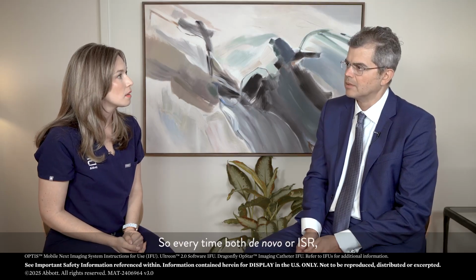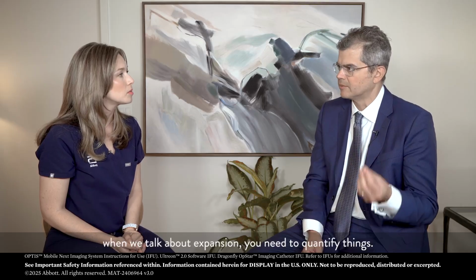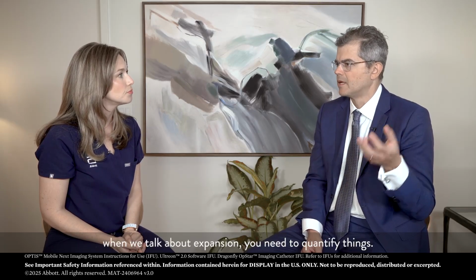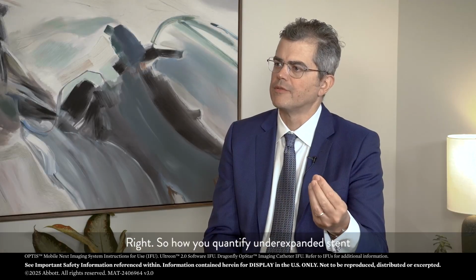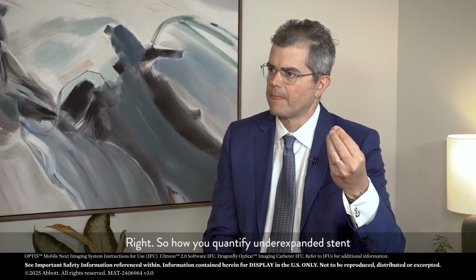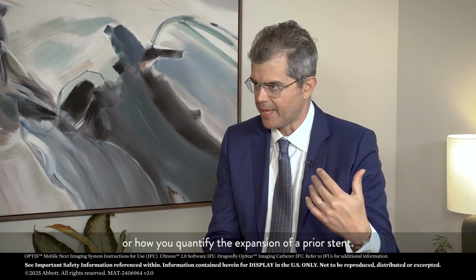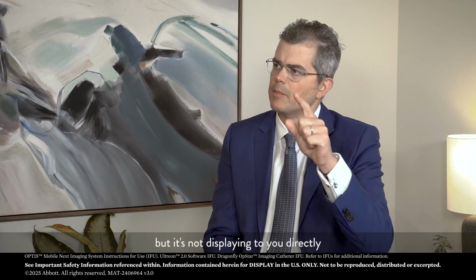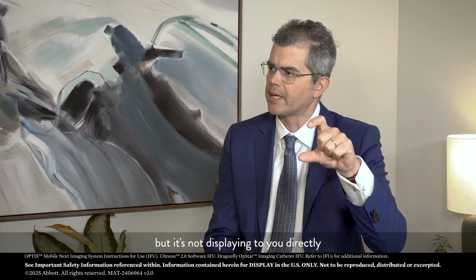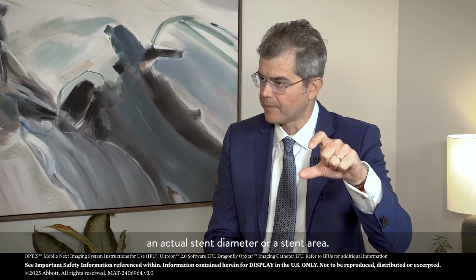Sure. So every time, both de novo or ISR, when we talk about expansion, you need to quantify things, right? So how you quantify an underexpanded stent, or how you quantify the expansion of a prior stent? The software, as you know, can detect the struts, but is not displaying to you directly an actual stent diameter or stent area.